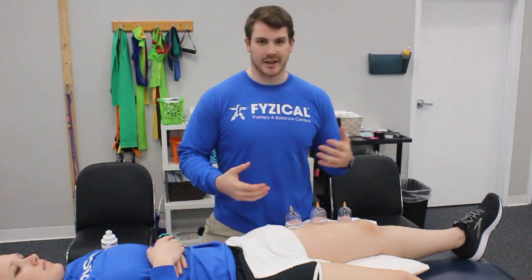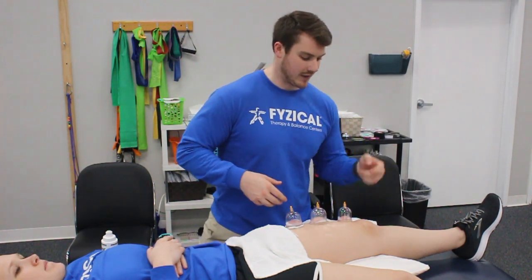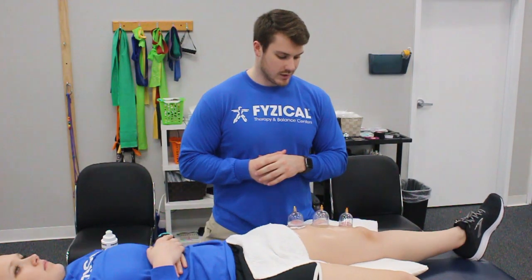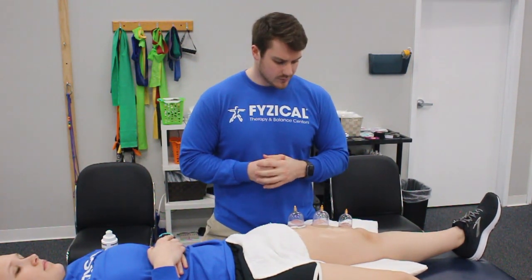We can leave this on here, but like we do before, I like to use movement during this. What I'm going to have Megan do is press the back of her knee into the pillow and then relax — five times — to help move the muscle tissue and get some more blood flow to the area.